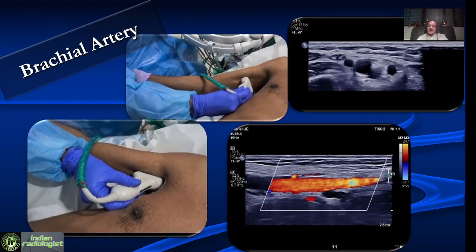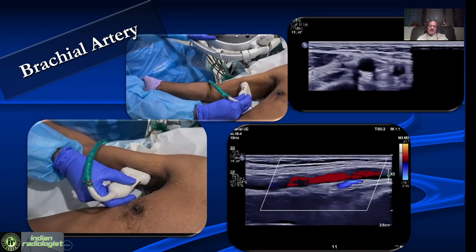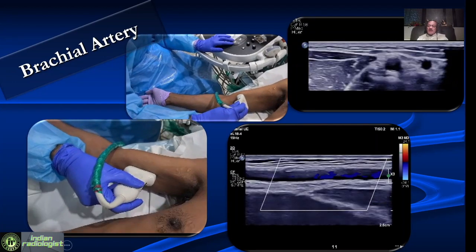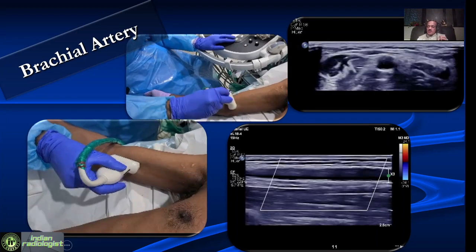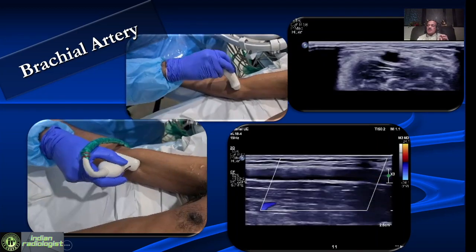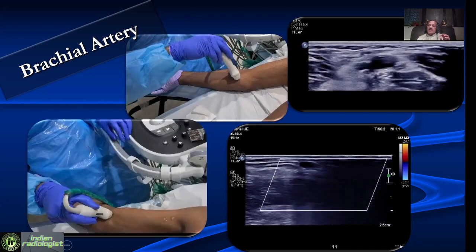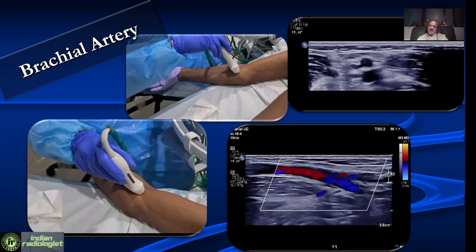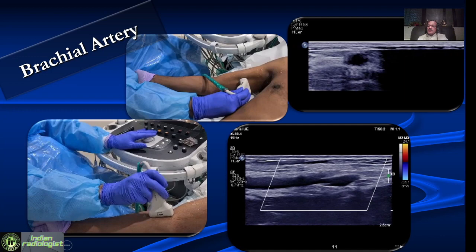The brachial artery we trace medially along its entire extent, right from the axilla to its bifurcation. It is very important to evaluate the brachial artery in a transverse plane as well, because not only can we see the lumen well, but we can also pick up any anomalies. For example, very often we see a high bifurcation of the brachial artery coming up in the upper arm, and this is very important information which we need to give to surgeons before doing a fistula surgery.